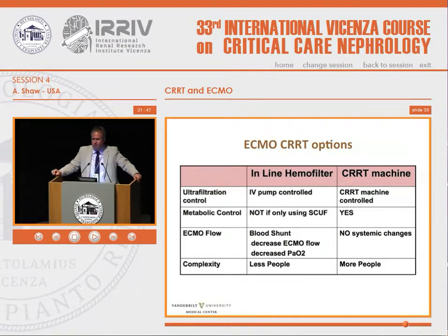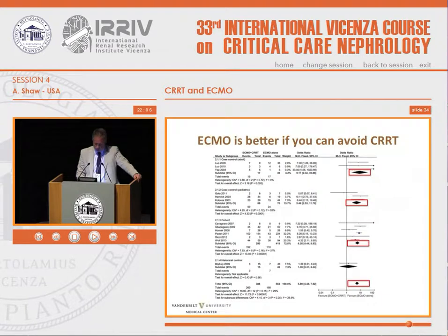And I would suggest to you that any intensive care nurse who is capable of managing someone on an ECMO circuit is more than capable of managing CVVH. In fact, we have an ECMO team of nurses who've been trained up to sit these patients, and they work with the consultant input from our pump techs who now no longer have to sit these.